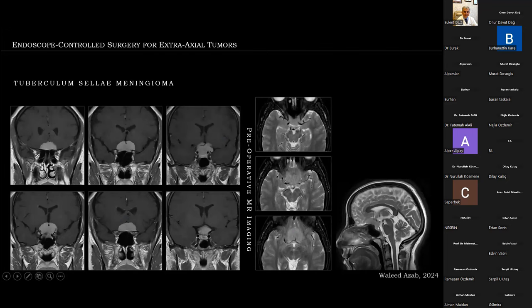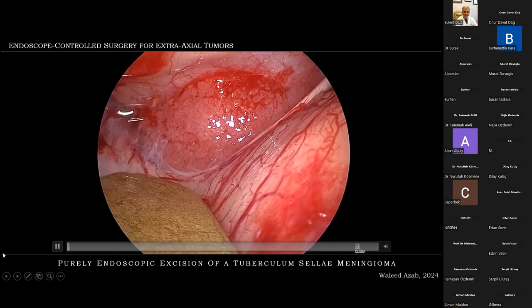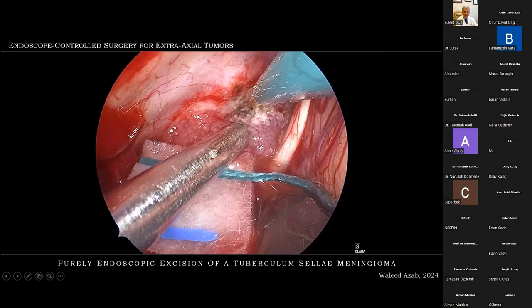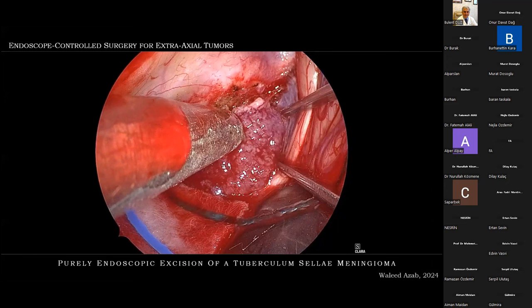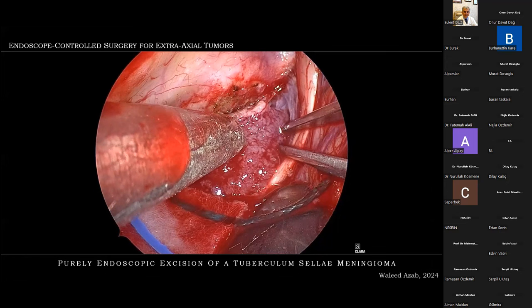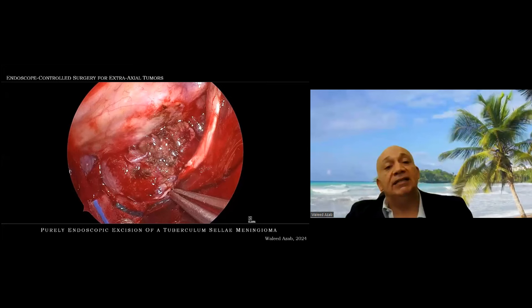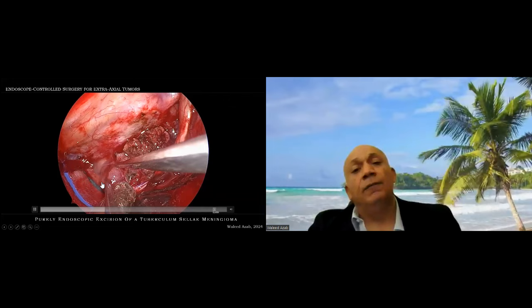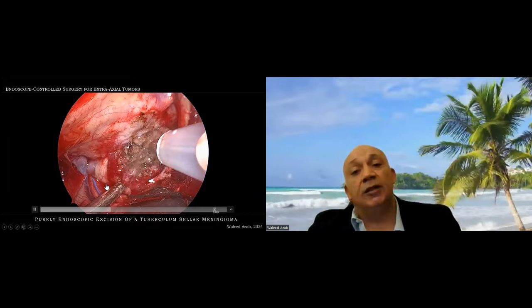I will share a couple of cases utilizing this surgical strategy. The first case is a tuberculum sellae meningioma in a 33-year-old lady who presented with severe visual loss, more on the left side — here is the pre-operative MRI. She was operated via an eyebrow approach on the left. The tumor is bipolar coagulated and devascularized from its attachment at the skull base, and the forceps is used to develop the arachnoid plane. The arachnoid is teased away from the surface of the tumor, and a glimpse of the left optic nerve is seen.